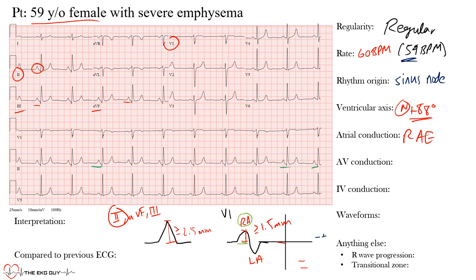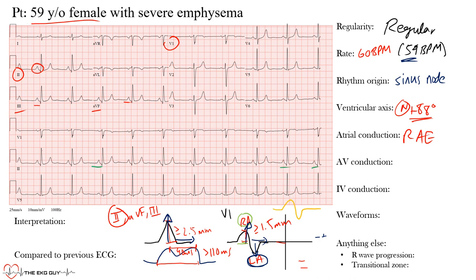With right atrial enlargement, we see peaking — increased amplitude — of the P-waves. With left atrial enlargement, you'd see increased depth and duration of the terminal portion: the two peaks should be at least 40 ms (one small box) apart, total P-wave duration greater than 110 ms (three small boxes). In V1, the terminal component should be at least 1 mm by 1 mm for left atrial enlargement. In this case, right atrial enlargement is present.